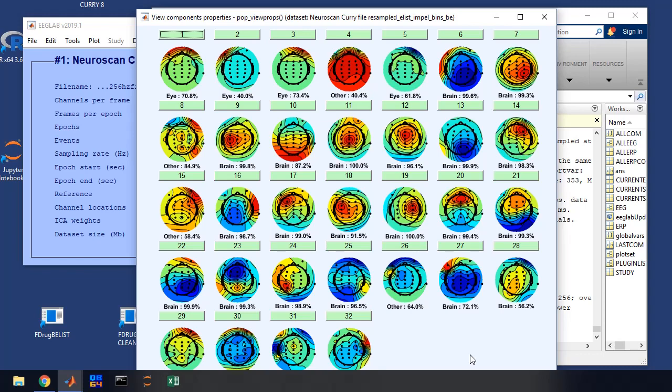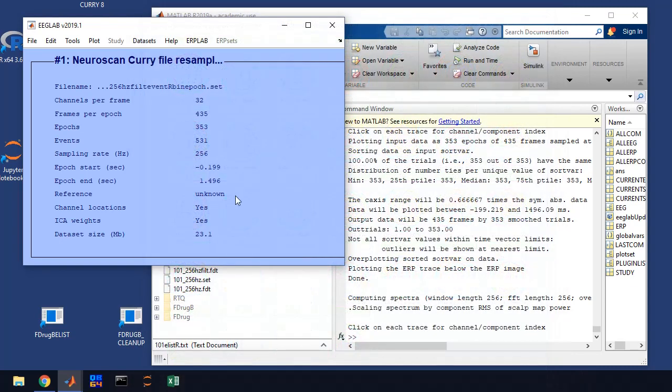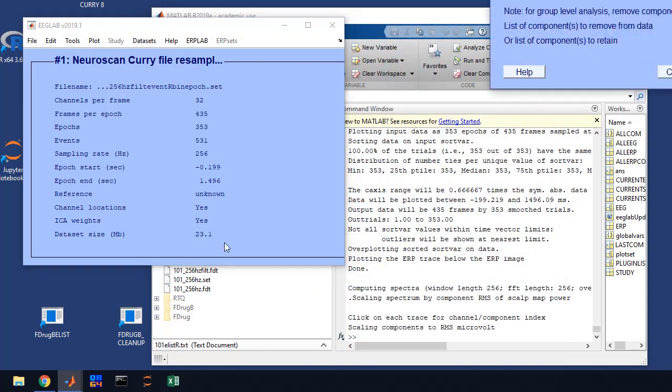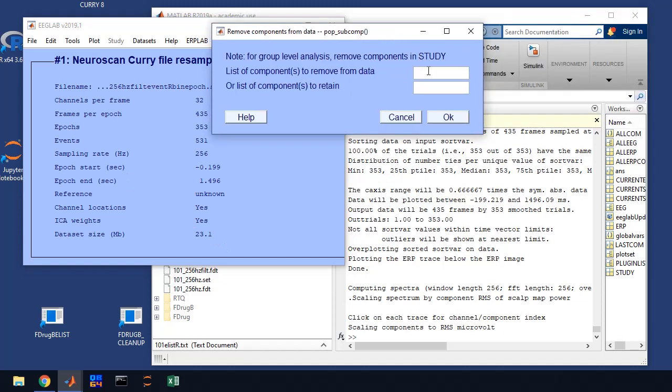So I'm going to take out those components. So it's one through five, eight and 15. So we've mapped those. So now let's remove them. So we go to tools, remove components from data and we get this window. And so we're going to list each component. You're going to put a little space in between it. So one, two, three, four, five, and then eight, and then 15. And you're going to click OK.